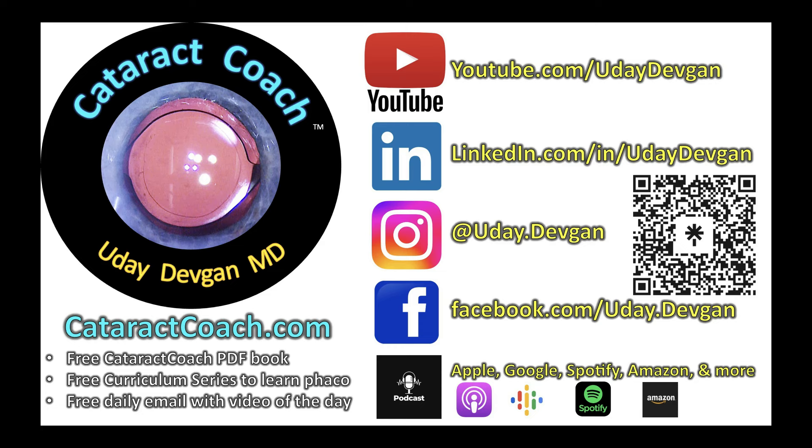Give this patient plenty of anti-inflammatories post-op because you're going to have a little bit of inflammatory reaction there. But beautifully done. Check out cataract coach on Instagram, Facebook, LinkedIn, or YouTube — check it out.